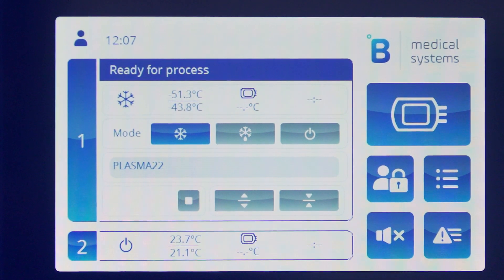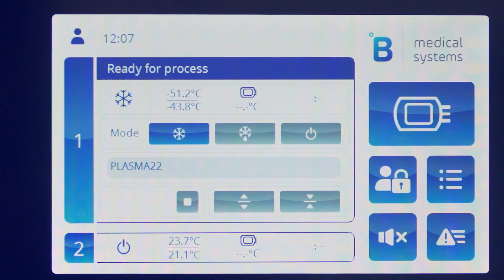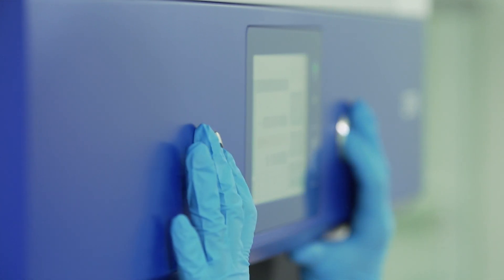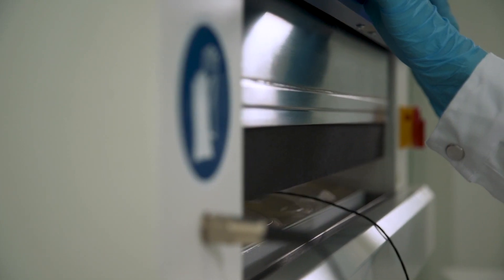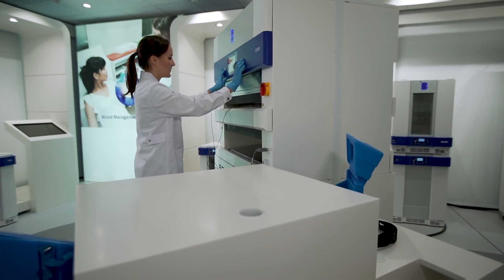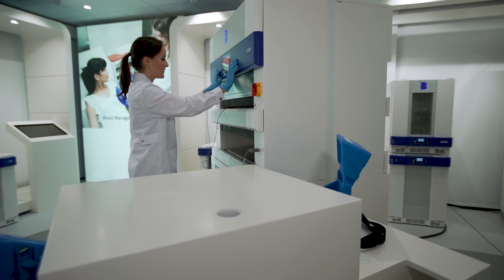You are now all set to start the freezing cycle. Close the plate by pressing the button simultaneously. The freezing will start automatically when an optimised pressure is applied on your bags. Lay back and let B Medical Systems do the work.